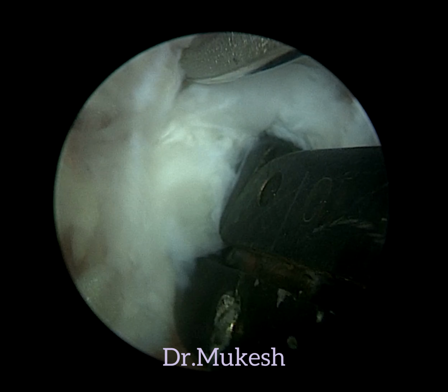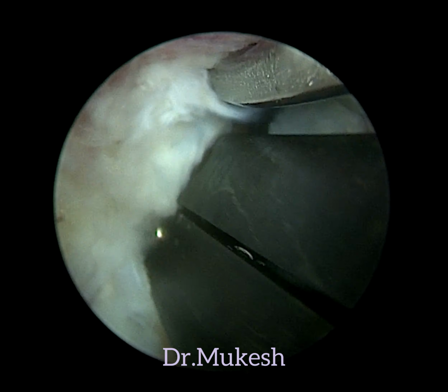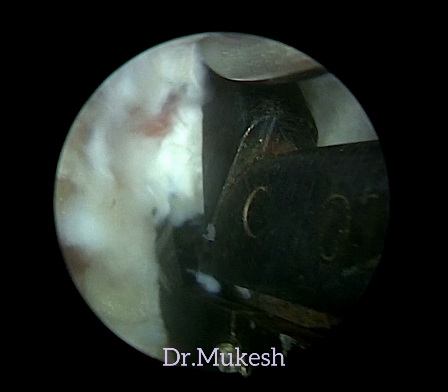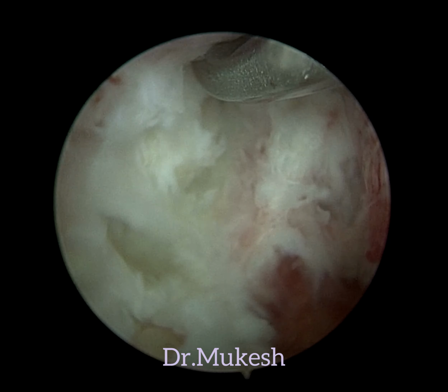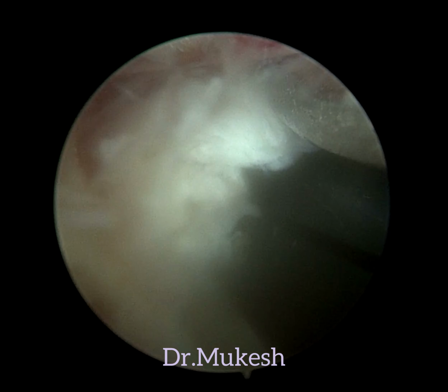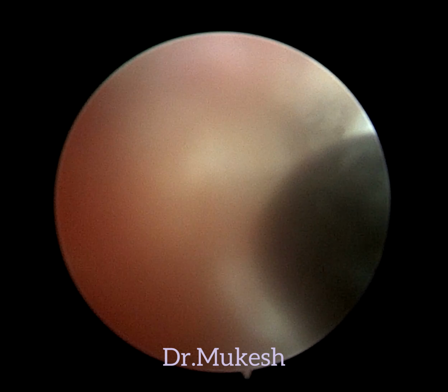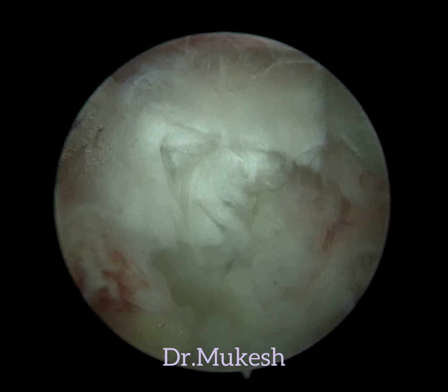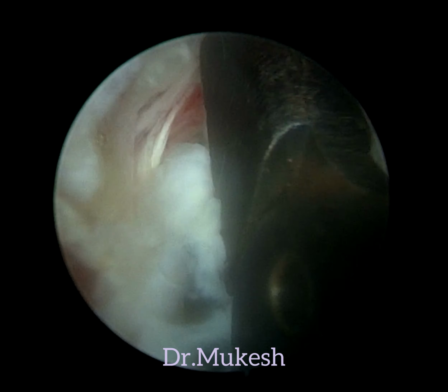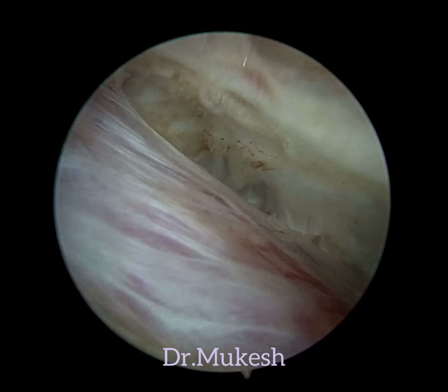these all the fragments they are taken out with specialized curved disc forceps or pituitary forceps, which is specially designed for such type of cases and very useful in a UBE surgery, whether this is a discectomy or decompression. Especially for contralateral work, this curved instrument or curved disc forceps is really very useful.